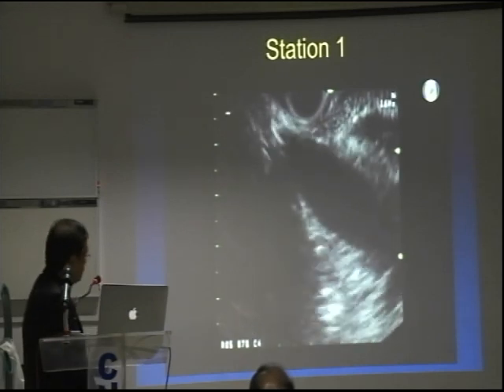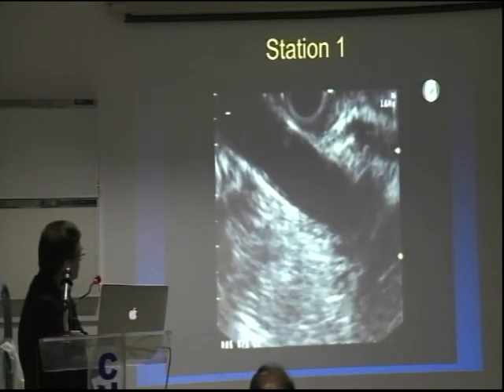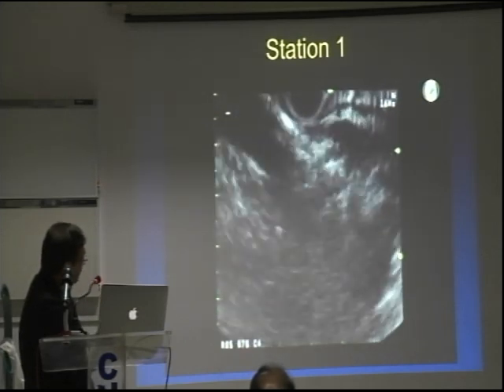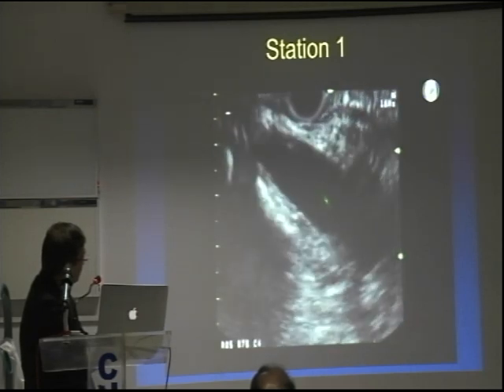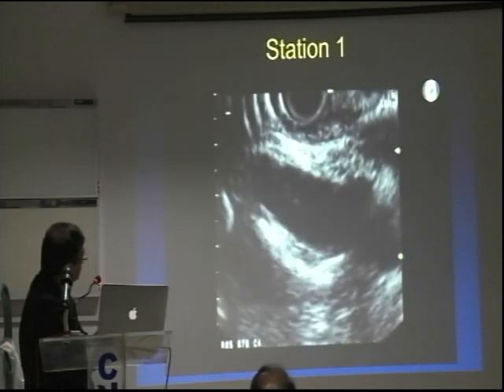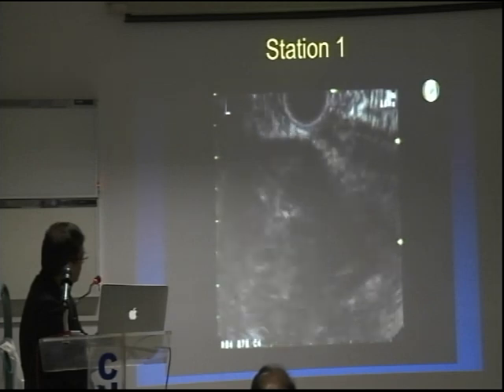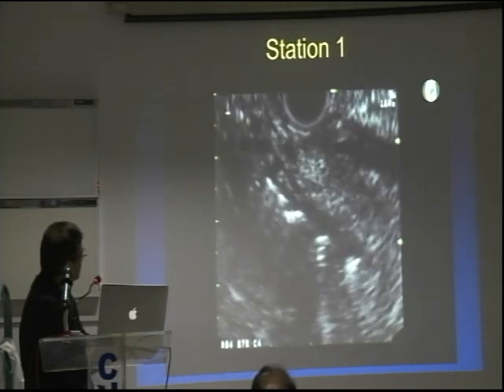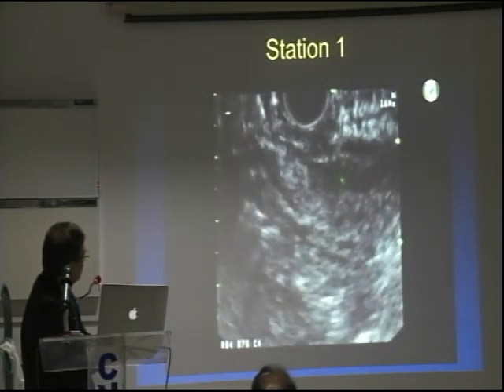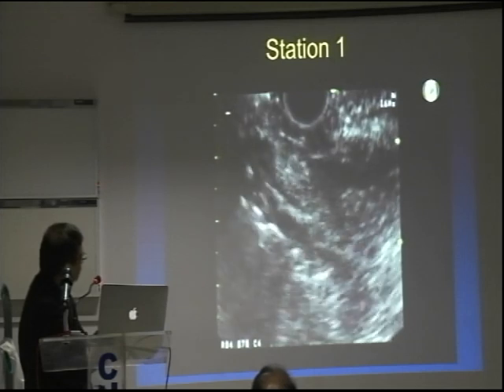And with withdrawal, one needs to apply clockwise and counterclockwise torquing in order to image the pancreatic uncinate. As one withdraws, the aorta is typically out of the visual field. It may dive deep into the pancreatic head. On this video, one can see that as we have withdrawn, we have come up squarely on the pancreatic uncinate, and we can now visualize the pancreatic duct.